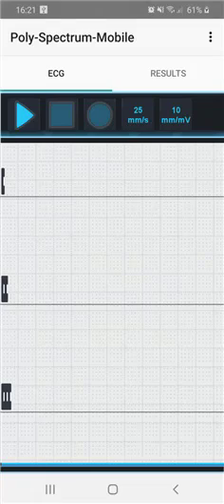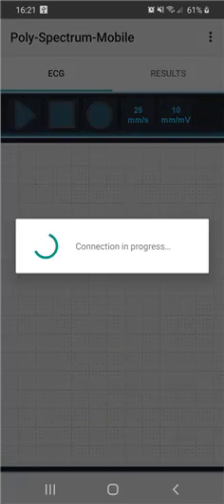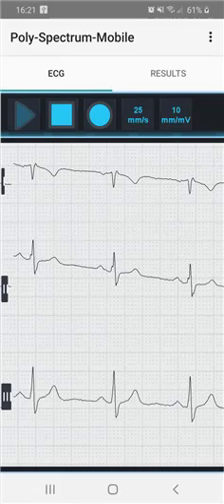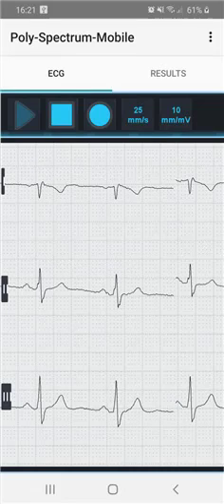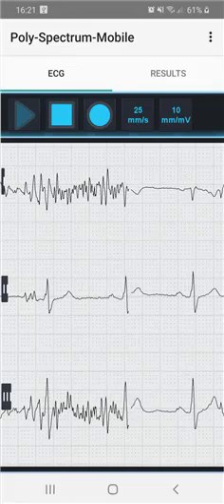I press the monitoring button. The signal received from the ECG recorder will appear on the screen. I press the record button to start ECG recording.